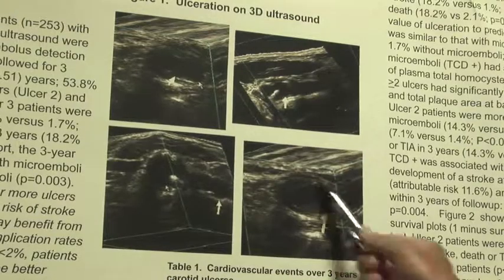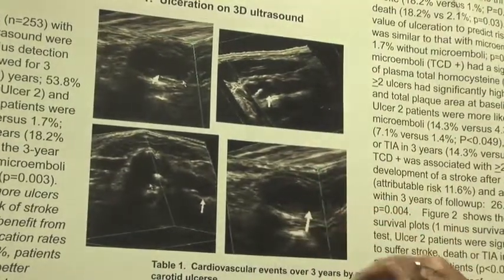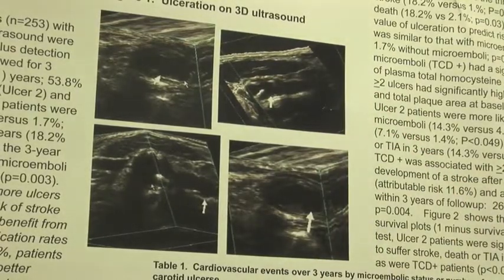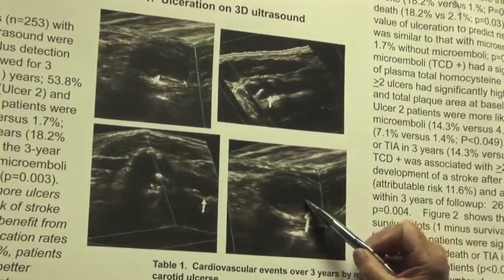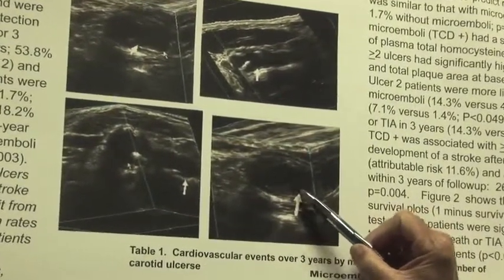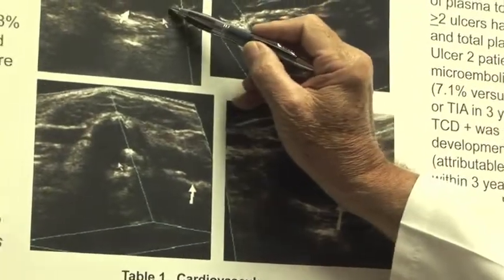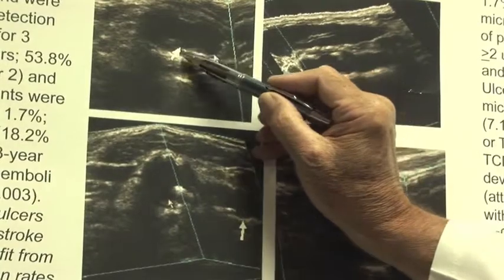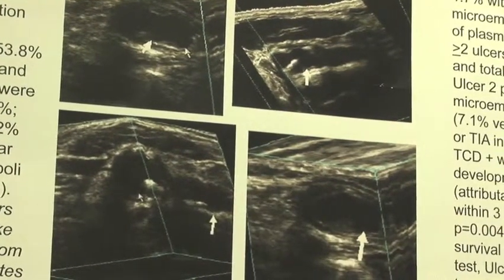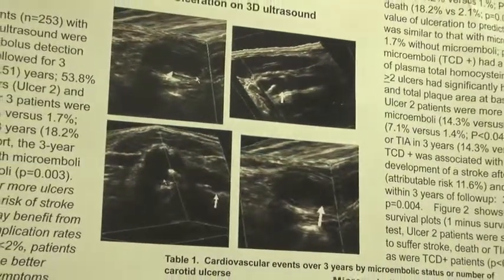Yeah, so these are three-dimensional images of the carotid arteries. This slice here is in a cross-sectional view. This is a longitudinal view of the artery. And these arrows are pointing to places where some of the plaque has broken off and gone up into the brain. So that's a big ulcer in this cross-sectional view. Here's a smaller ulcer here. Here's another big ulcer in this cross-sectional view, a smaller ulcer there. So these are all little ulcers, which are defects in the surface of the carotid plaques that mean that that plaque has been unstable.